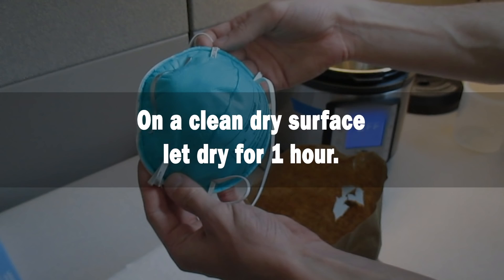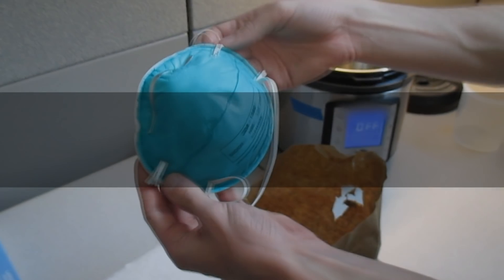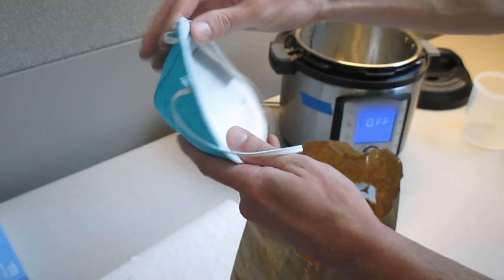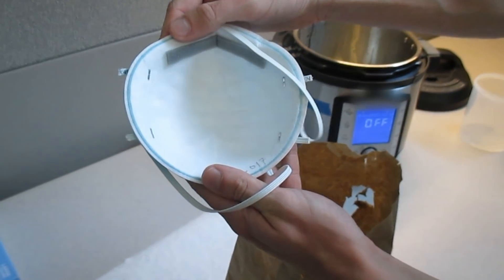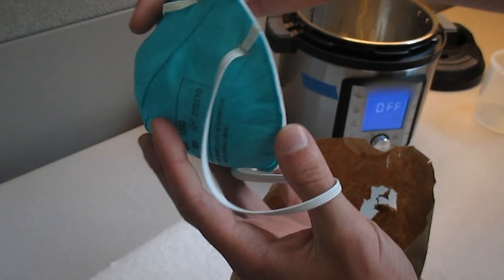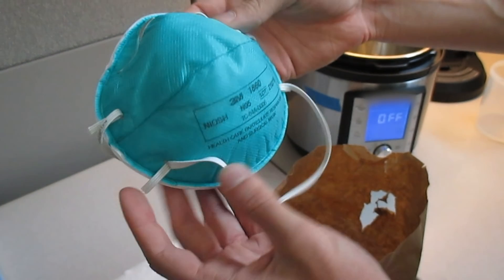An hour should be sufficient for the mask to dry. Once dry, examine the mask for any potential damage, including the nose foam, strap attachments, and other accessories. If there is any damage, then discard the mask. If not, then the mask is ready for reuse.